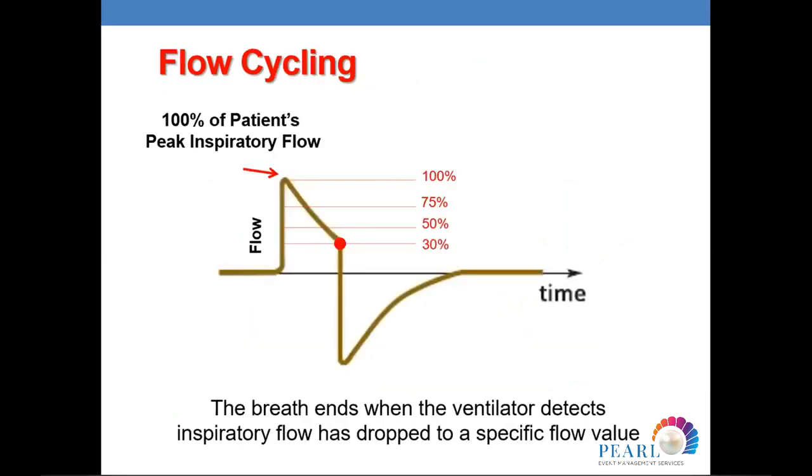Now we mentioned the cycling. This is the time the expiratory valve will open. Usually in most of the ventilator modes we depend on the inspiratory time. So in assist control, in SIMV, or in continuous mandatory ventilation, all of those modes depend on the I time. So this is time cycling. When the time finishes, the expiratory valve will open.